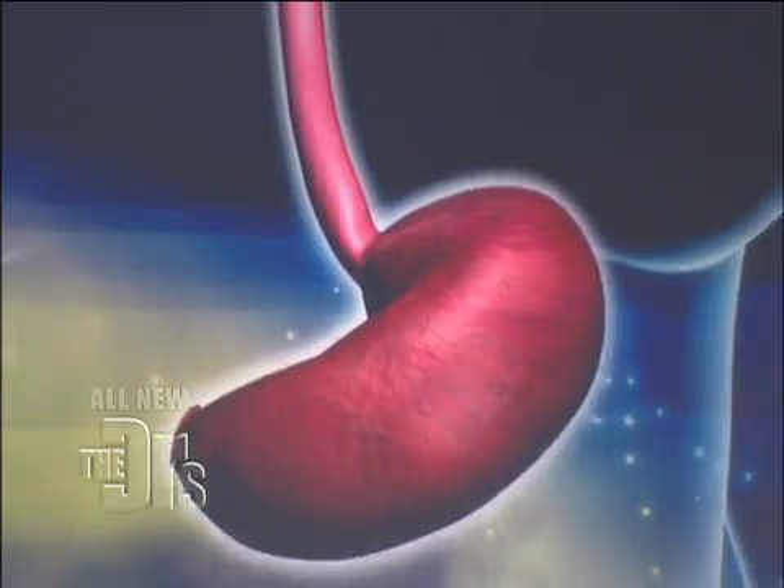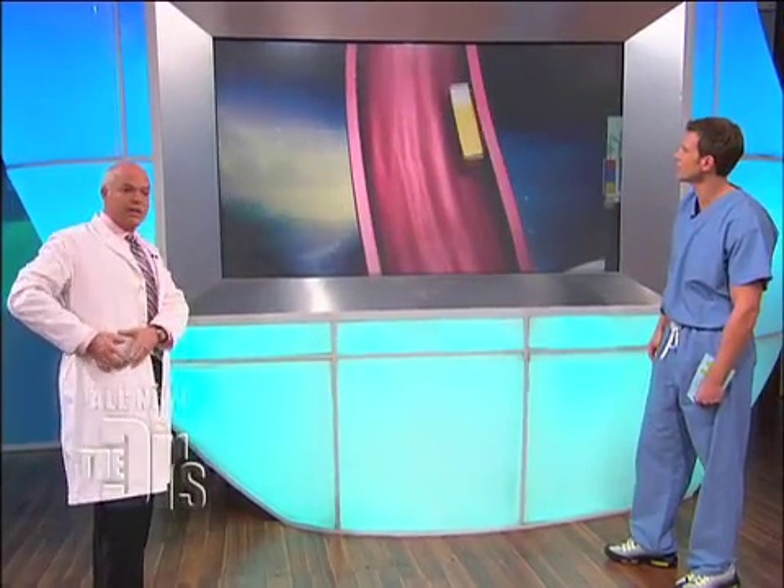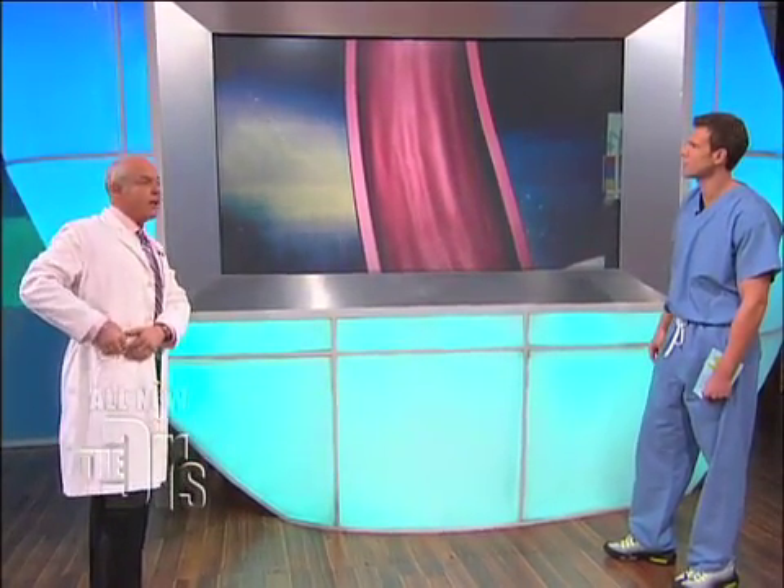Two days later it'll just desuction. And this is an animation of that device. You may wonder what happens after it desuctions — it just goes down the intestines and out, so we don't have to retrieve it. In the meantime, it's sending all this information to a little transmitter that you have right here on your belt.